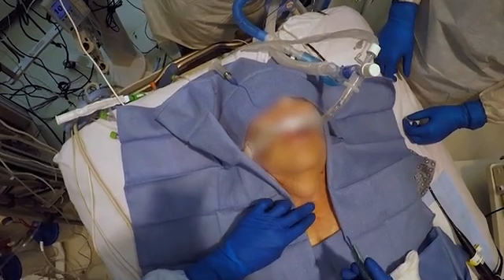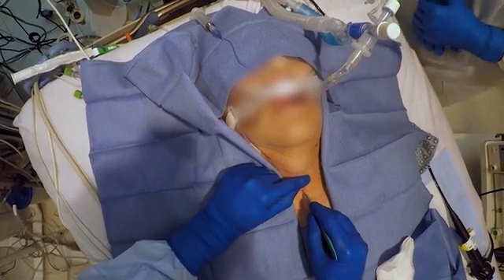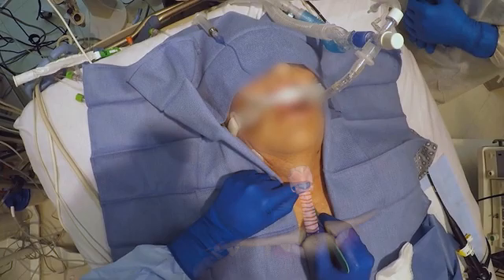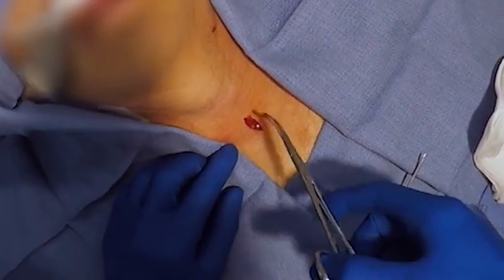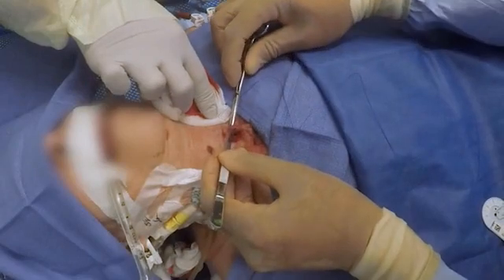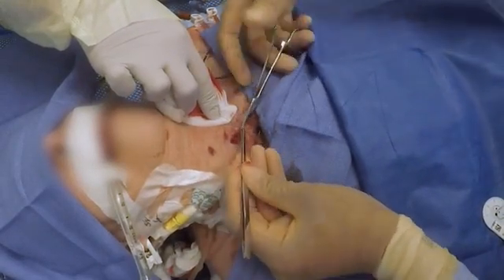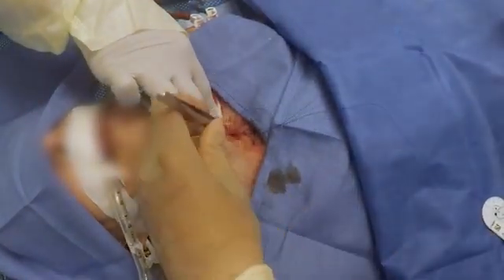Sterilize and drape the anterior neck, making sure that the draping allows easy access to the oral endotracheal tube. Make a 2–3 cm vertical neck incision that directly overlies the trachea below the cricoid cartilage. Bluntly dissect the pre-tracheal tissue with a dissecting tool until the trachea is clearly palpable. In patients who require therapeutic anticoagulation, or in whom there is any risk of bleeding, it may be advisable to place a purse-string suture around the tracheostomy incision using a 2-O proline suture.